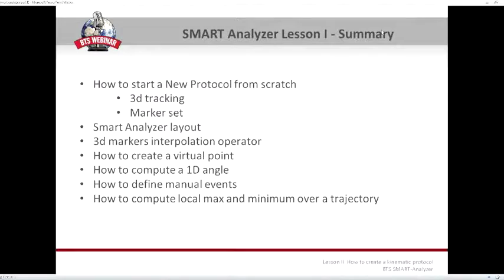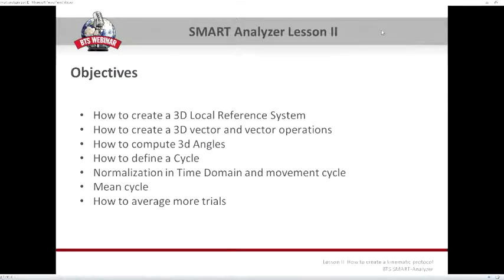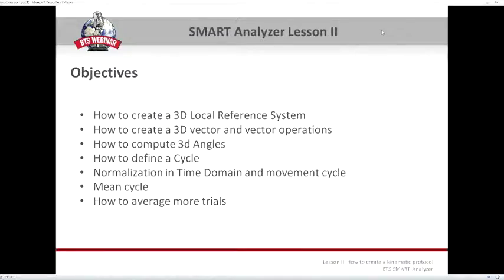During today's webinar session, we will learn more about 3D operators. In particular, the objectives are to learn how to create a 3D reference system local to a body segment, how to create a 3D vector and perform basic vector operations, how to compute a 3D angle between two body segments, how to define a cycle in a movement, how to normalize data into the time domain, how to define cycles and a mean cycle, and how to apply the same operations to different trials and get average results.